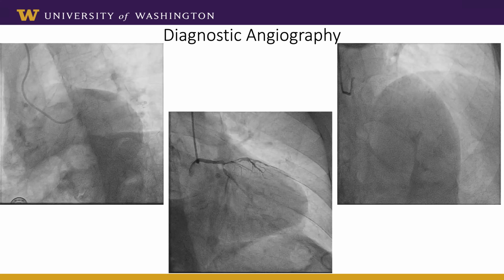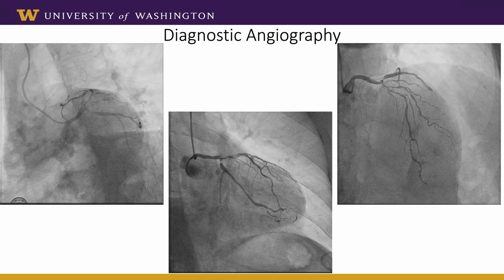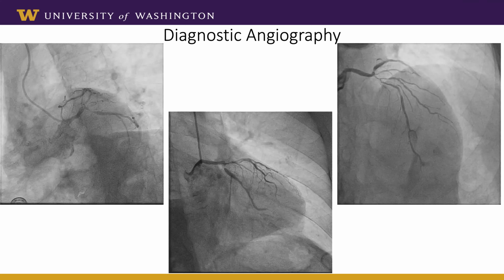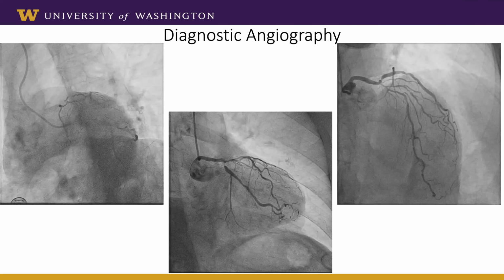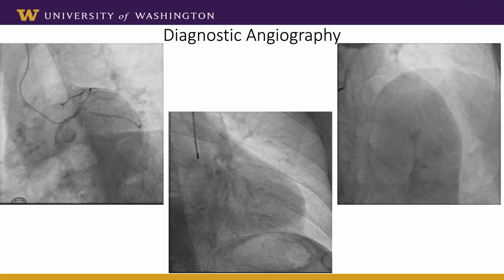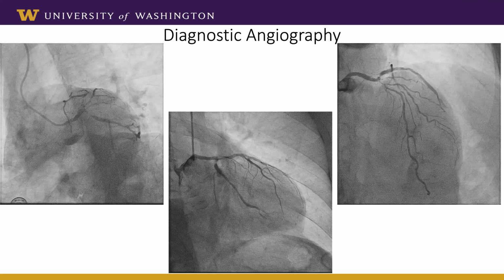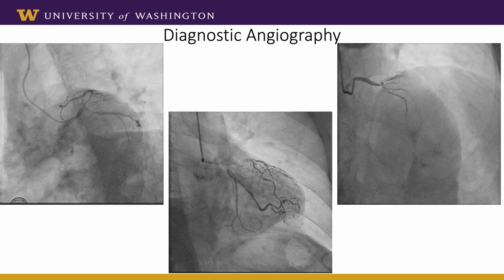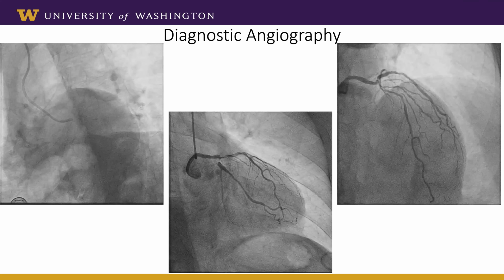Yeah, exactly. I think that was a big reason why we thought CABG was reasonable to consider in him. It's not the rest of it, but just what's our likelihood of a durable result, where a lot of his disease territory that we're stenting across is the bulk of the branches supplied by his LAD, because that diag comes all the way down the wall. But yeah.